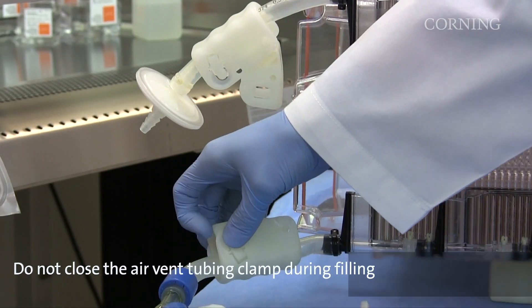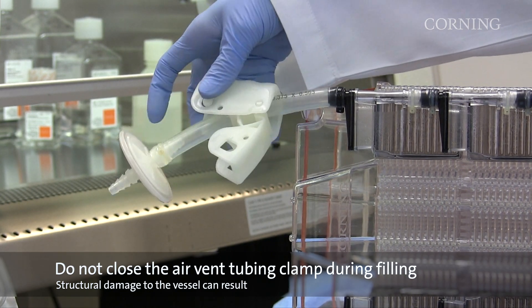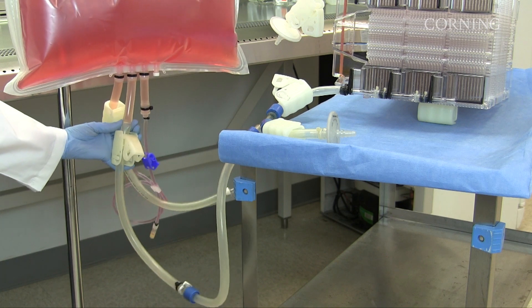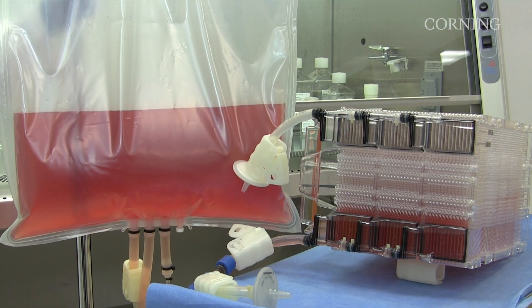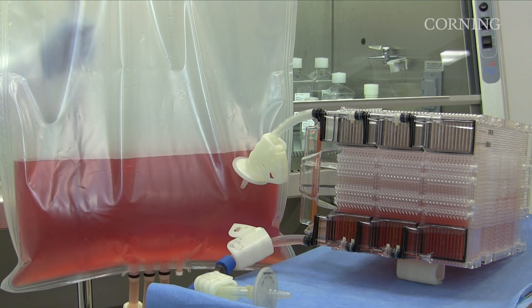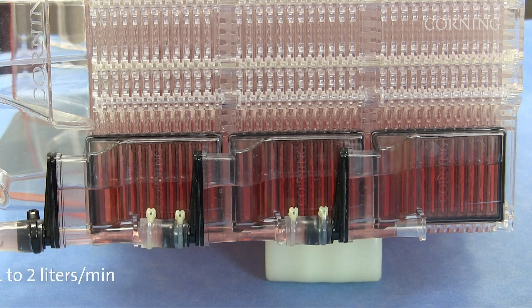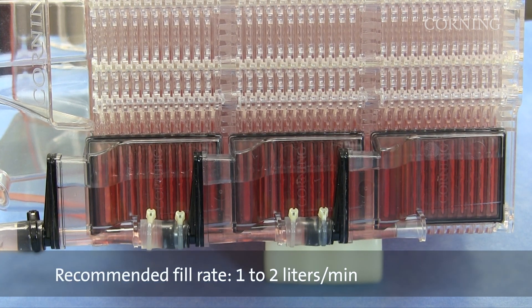To begin filling, open the liquid handling tubing clamp and air vent tubing clamp. Open the source vessel clamp to allow media to fill the Hyperstack vessel. To control the fill rate, slowly raise or lower the height of the source vessel to increase or decrease flow. The recommended rate for pump or gravity filling is 1 to 2 liters per minute.